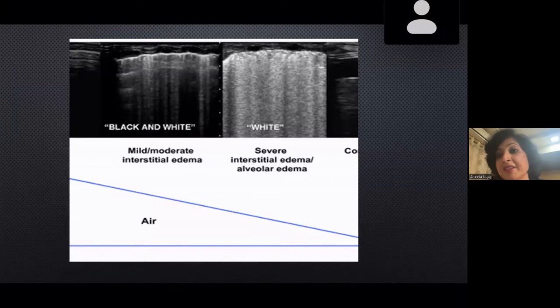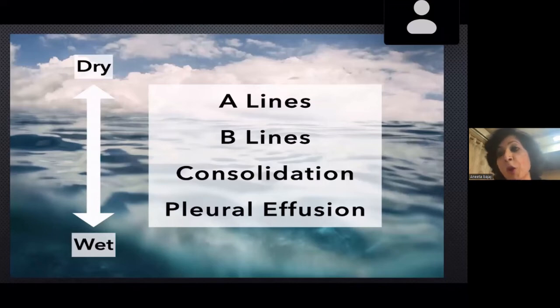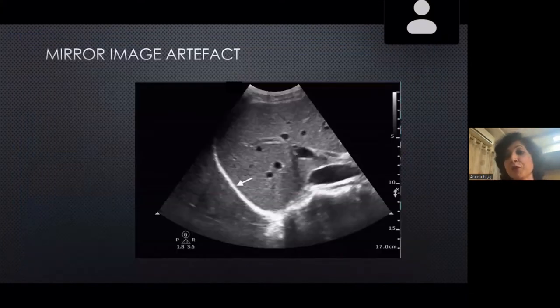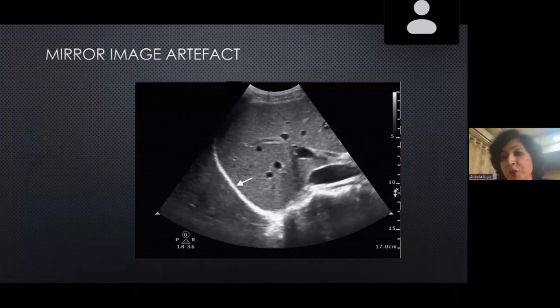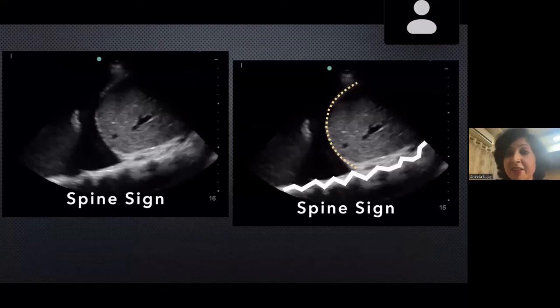From black to white represents mild to moderate to severe interstitial edema and alveolar edema, then consolidation turns things dark again. A normal dry lung shows A-lines; as it becomes a wet lung you start seeing B-lines, consolidation, and pleural effusion — all abnormal. The mirror image artifact — a reflection from the diaphragm showing the liver mirrored beyond the pleura — tells us everything is normal. The spine sign, where pleural effusion is so large you can visualize the spine, helps diagnose pleural effusion.